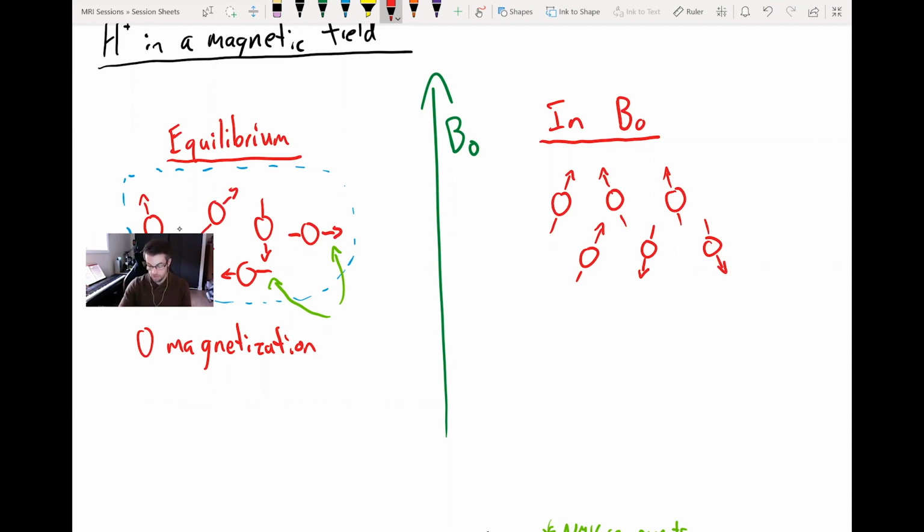As a rule of thumb, I initially learned that these magnetic fields can only be in one of 2 states, either oriented up or down, and that really simplifies things. You can definitely think of it that way, and it causes you no problems at all. It gets a little bit more confusing if you read further, as I made the mistake of doing a couple times, as to what is actually going on with each individual particle or spin.